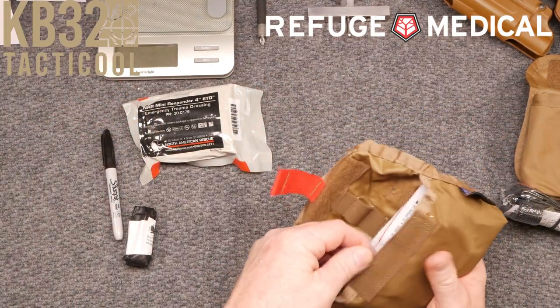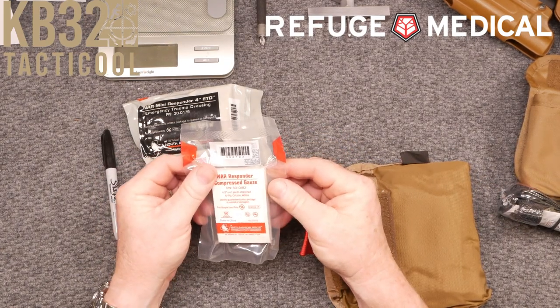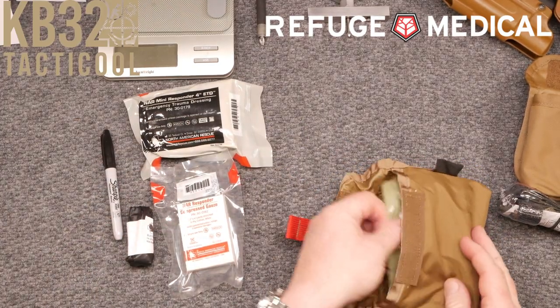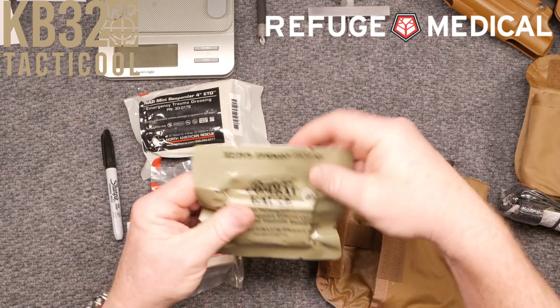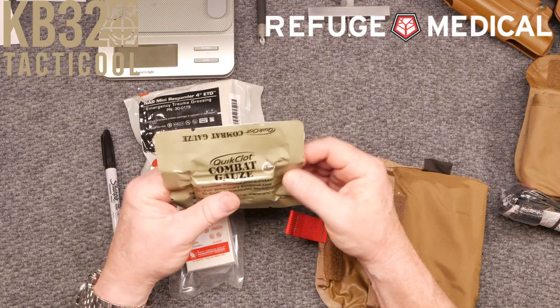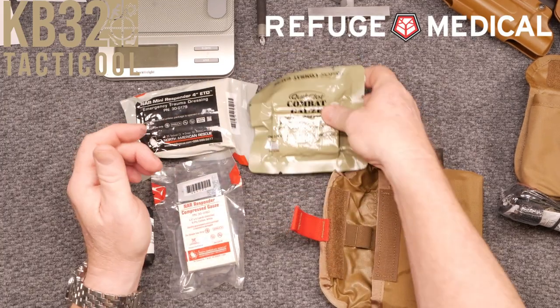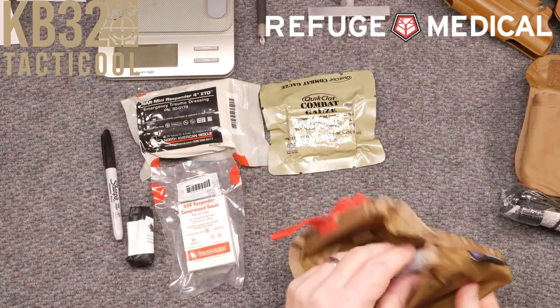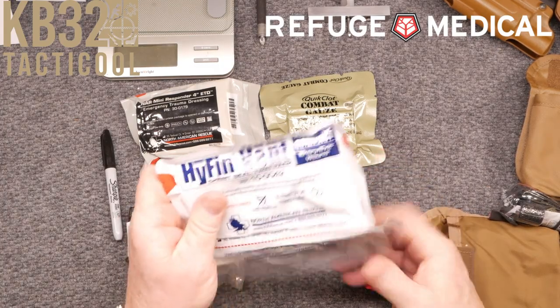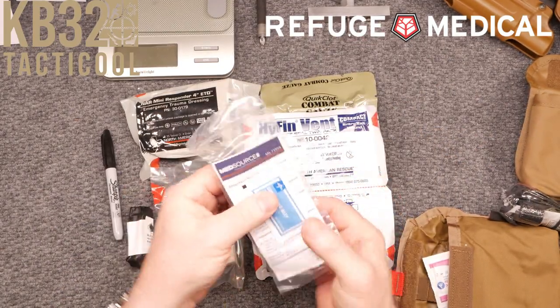Next we have the combat gauze — vacuum pack, Z-folded, for temporary external use and controlled traumatic bleeding. Then we have your HyFin vent chest seal pack, nasal airway, and lubricating jelly.